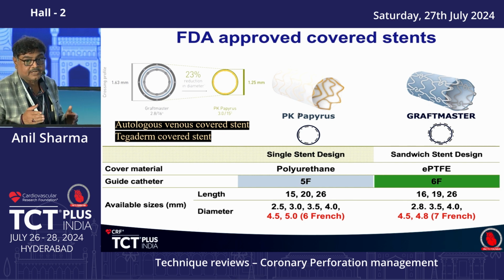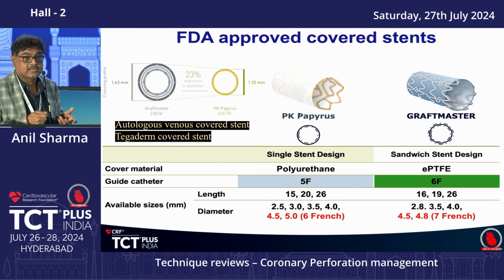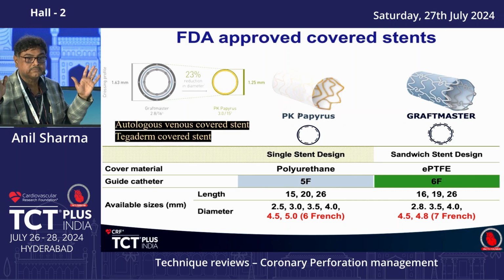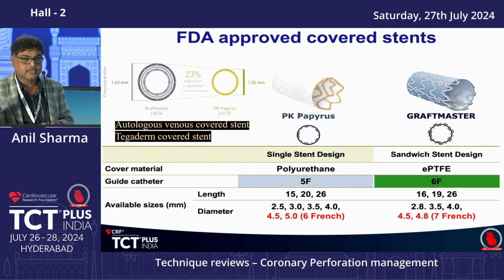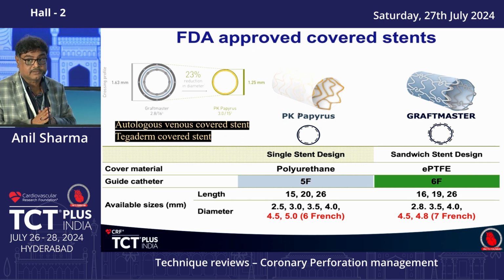So a couple of points I will just try to reiterate again. One thing is that before putting covered stent, remove all the stuff, because when there is a wire, balloon, you are in hurry. When all are sitting here with some calm, it's okay. But when perforation occurs, you are perspiring differently and you become like anything. So just removing, putting. So always before inflating, check that there is nothing outside the covered stent.